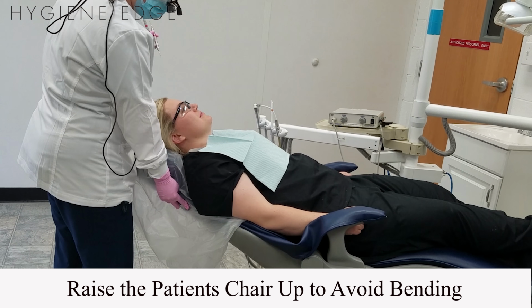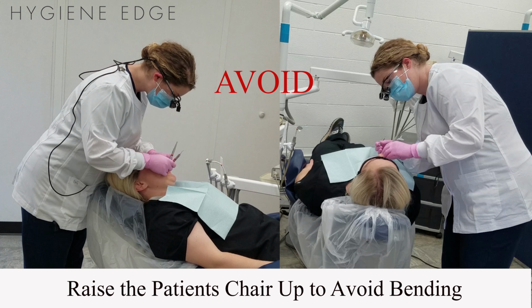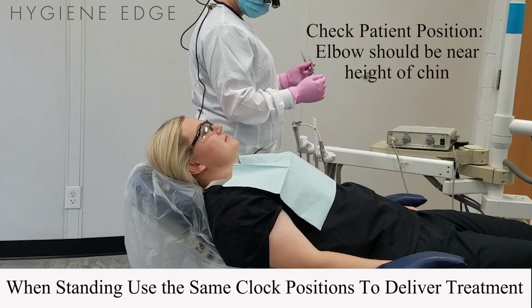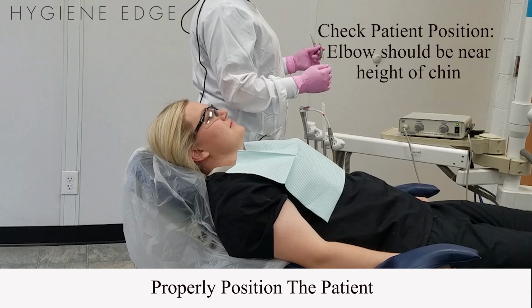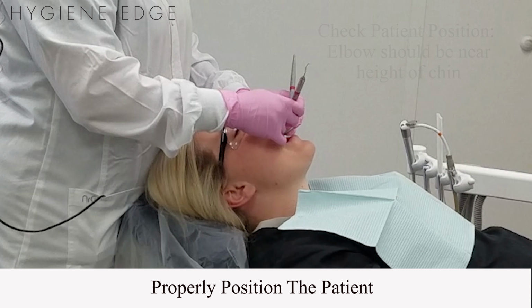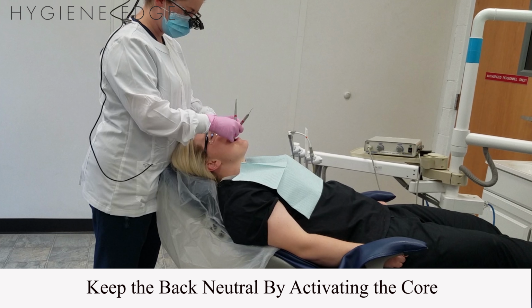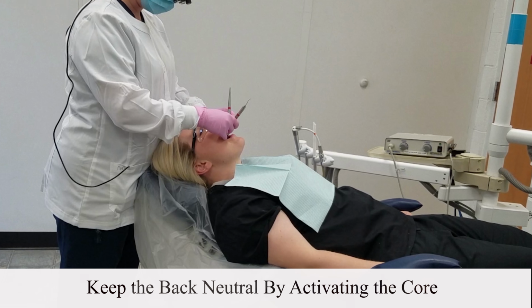To stand, bring the patient chair up to you. Do not lean over your patient. You should deliver treatment in the same clock positions that you would do when sitting. Make sure that you move the patient's chair and head as needed to maintain posture. Make sure at any of these positions that you stabilize your lower back by pulling your stomach muscles in towards the spine.